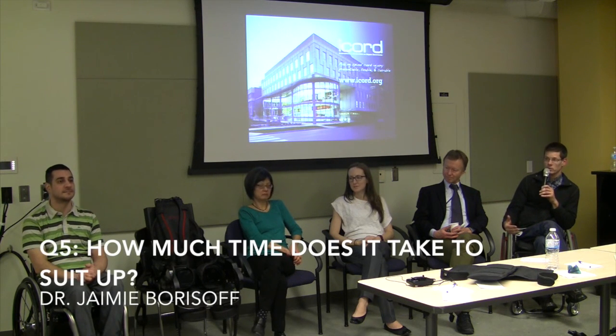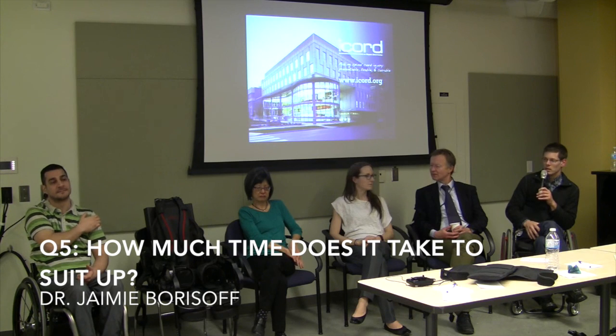And I think the companies have different strategies for how you get in and out of exoskeletons. I think the ReWalk is probably the worst in that regard, that they haven't done a lot, but they were one of the earlier companies. The Ekso has hinges on it so the leg can swing away, so you can move your wheelchair up closer to it for the transfer. The Indigo exoskeleton is modular, and you can strap it onto you while you're sitting in a chair. If you think about Iron Man, how it assembles around him, that was their strategy. So they're acknowledging that getting into and out of these things can be quite a challenge, so they're looking at different ways to facilitate that.